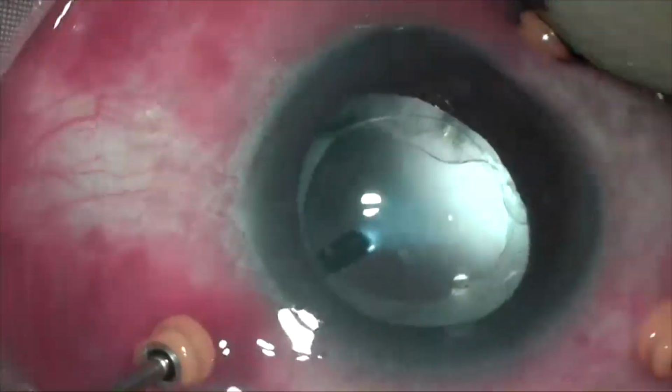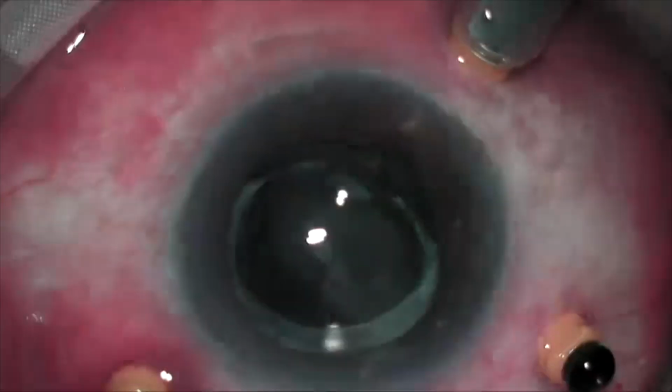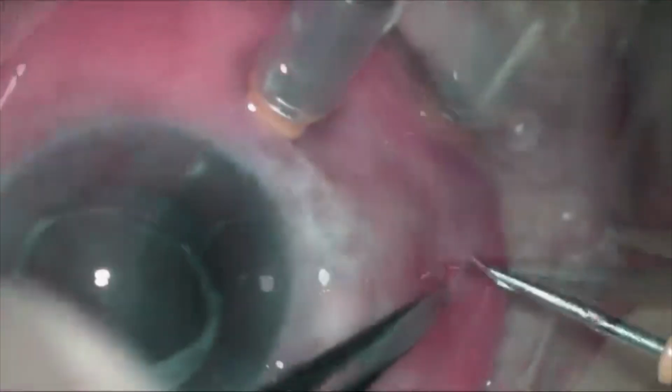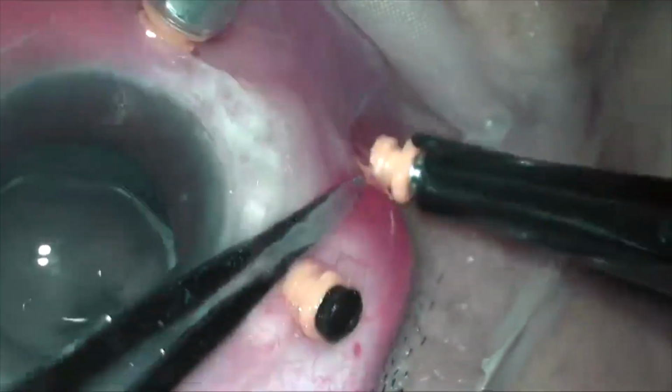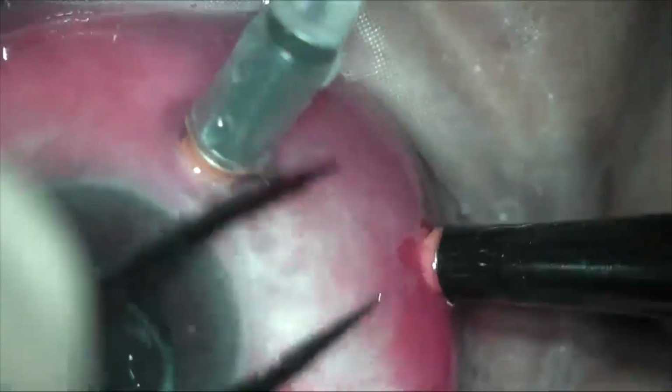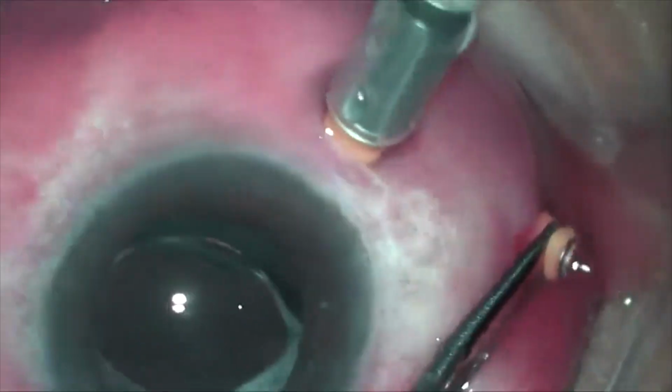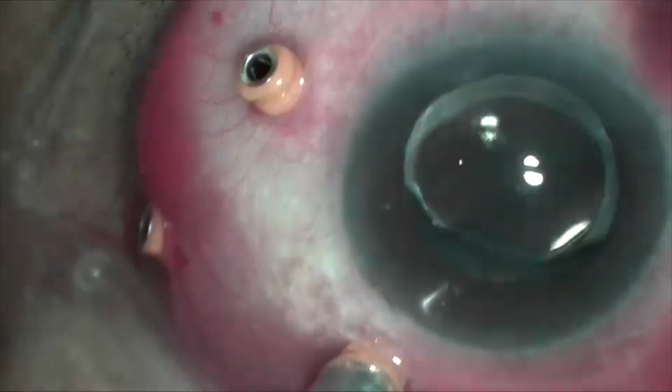Choroidal detachments can hit you out of the blue during intraocular surgeries. Pre-existing choroidal detachment with rhegmatogenous retinal detachments needs specific measurements. You do choroidal drainage along with surgical repair of RRD.